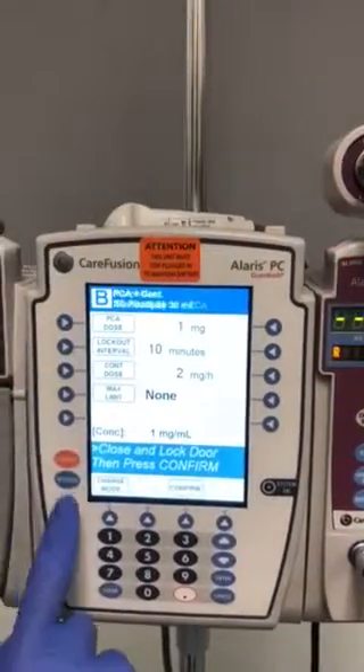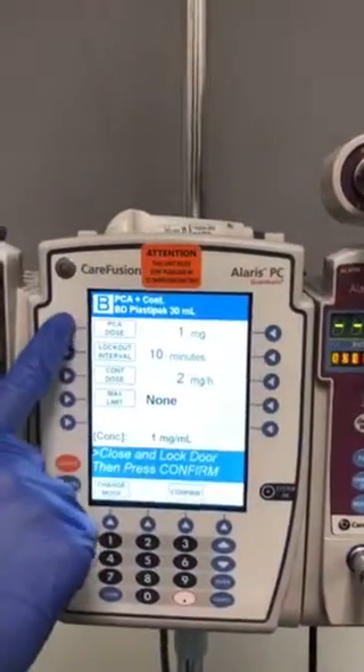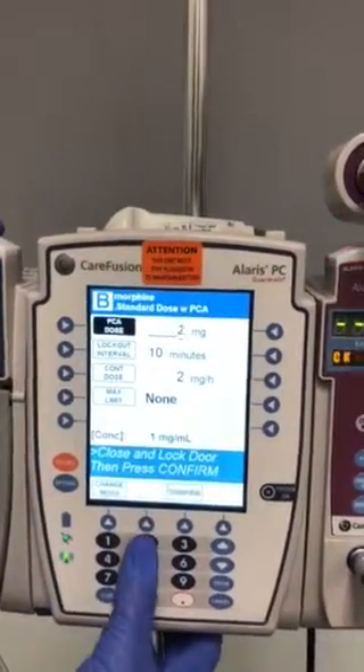This will give you an option to change your PCA dose. We're going to change that to two.